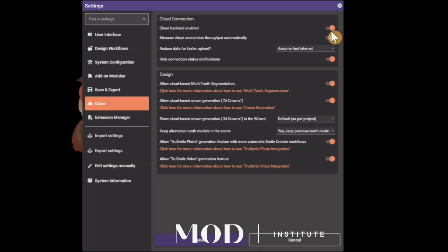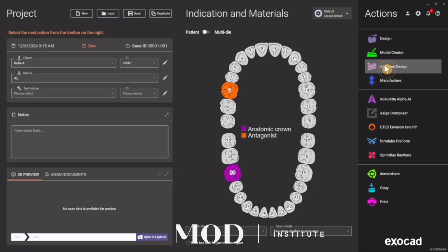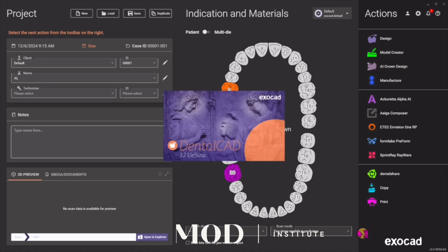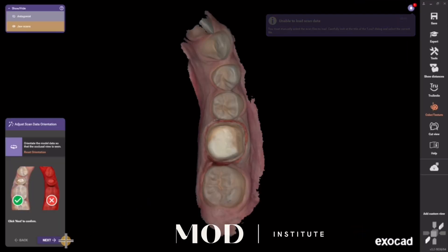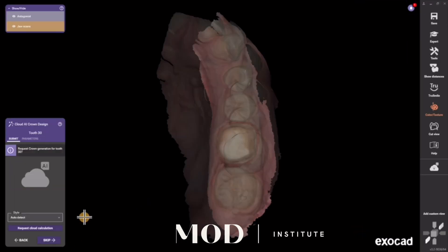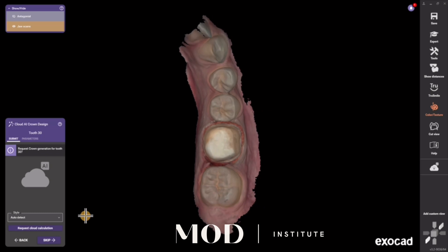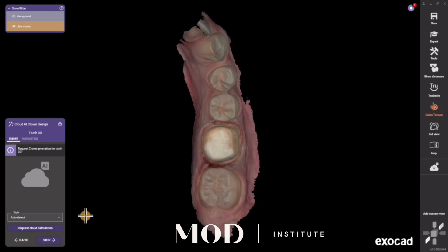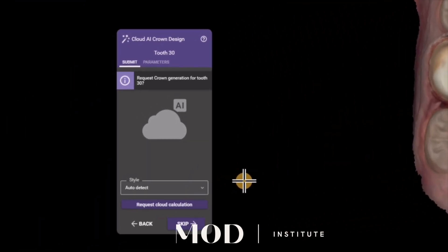Let's go through AI Crown Design. Go ahead and load a case and hit AI Crown Design. When the files come in, you'll get to the Crown AI Design screen where you can change parameters, but the default parameters are actually very well thought out.